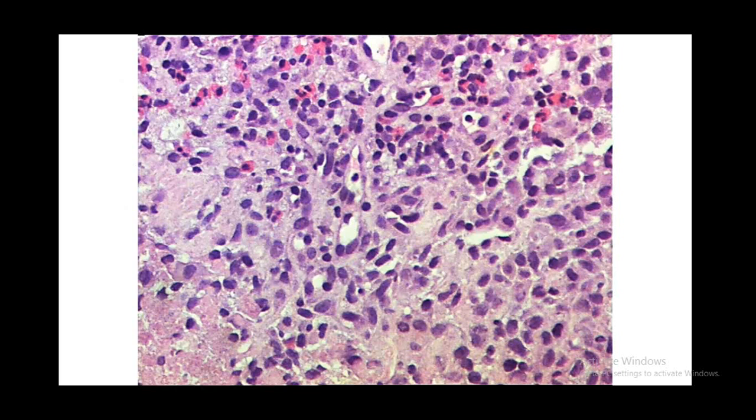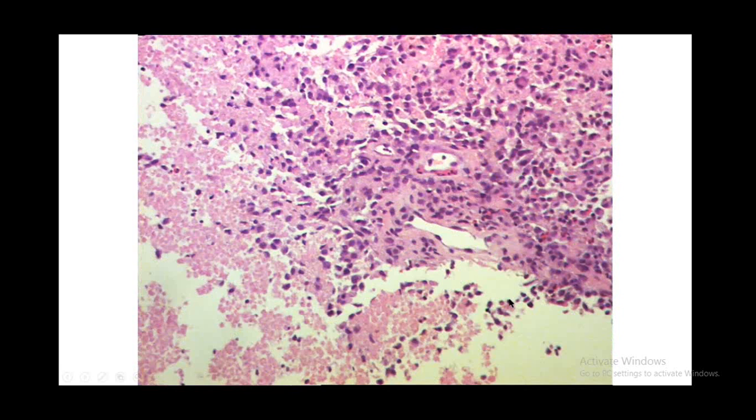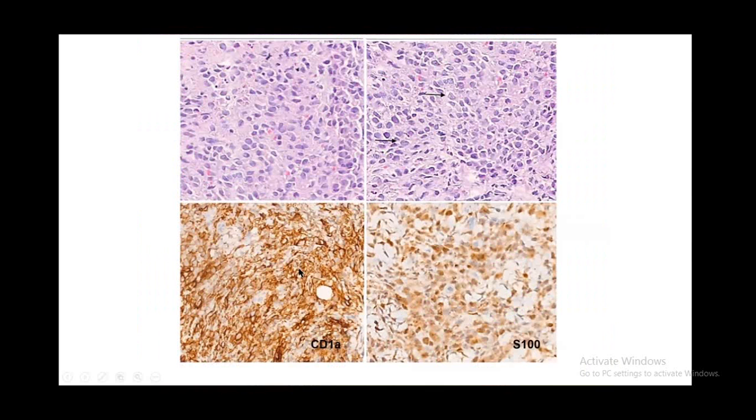The biopsy was performed. Surprisingly, the biopsy had many eosinophils admixed with these tumor cells, and the tumor cells showed this histiocytoid appearance. Areas of necrosis were seen, and these tumor cells with pleomorphic nuclei and coffee bean longitudinal grooves were very characteristic of Langerhans cell histiocytosis, or LCH.